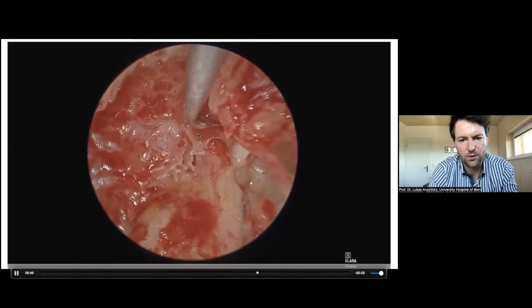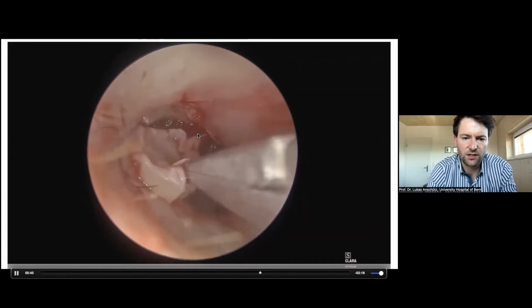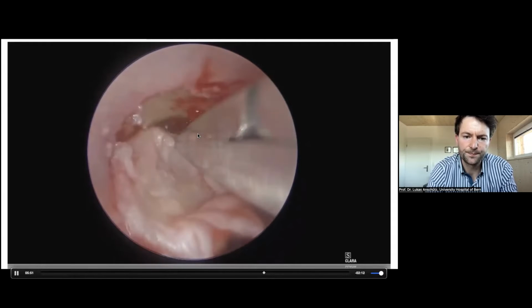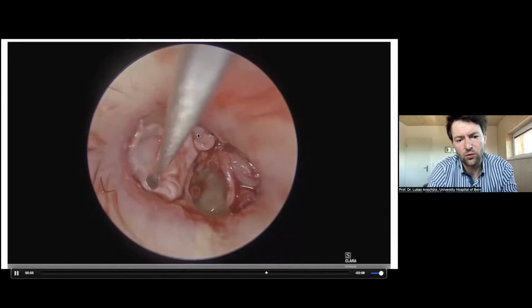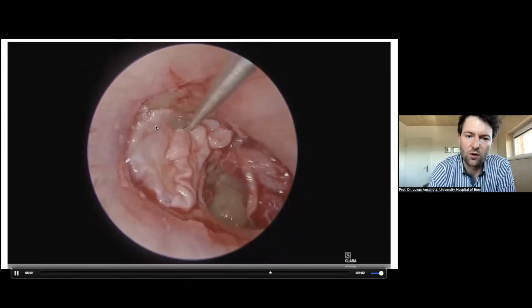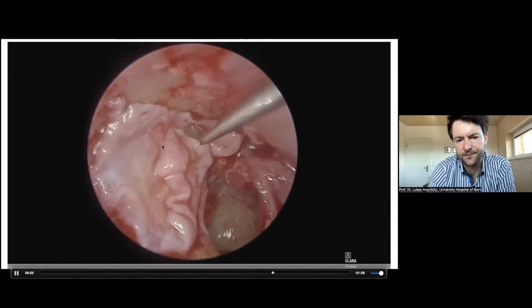So now I think we're all set. Cholesteatoma is gone and we can start to reconstruct. You can see I use some cartilage to reconstruct the defect that I created in the scutum. I usually use a composite graft. You can see on one side there is no more perichondrium. On the upper side, I leave the perichondrium, which then nicely holds my graft in the right position here.